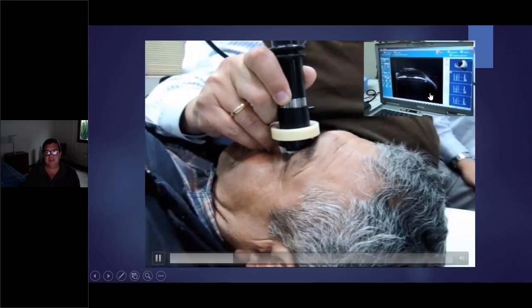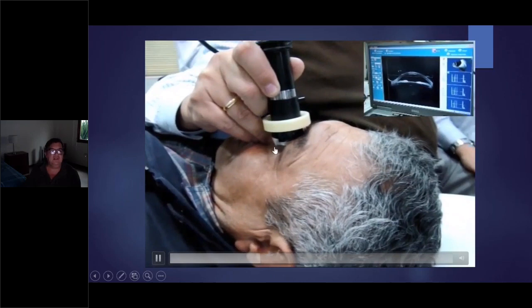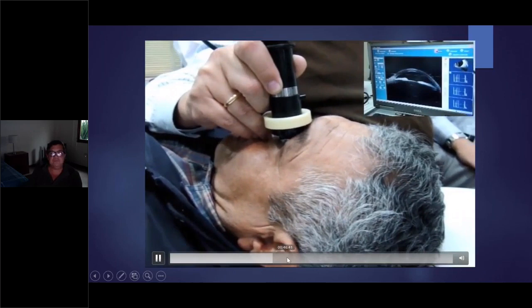And if you press or you do not press, you can be in focus. We will see that when we change the screen. Okay, there are two lines, and in between the two lines is the focus.